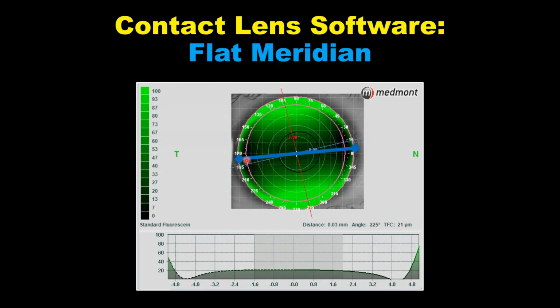And you'll notice when we take this 4.5 diopter corneal astigmat, that 0.9 millimeters of corneal astigmatism, a very high astigmat, we show the landing at 9 o'clock and the landing at 3 o'clock, and that's because this is the meridian of least sagittal depth. This is the most elevated meridian. And that's where our contact lens is going to want to touch down.